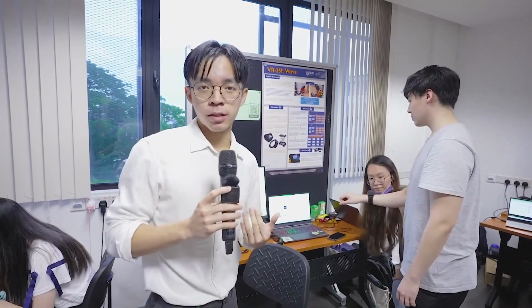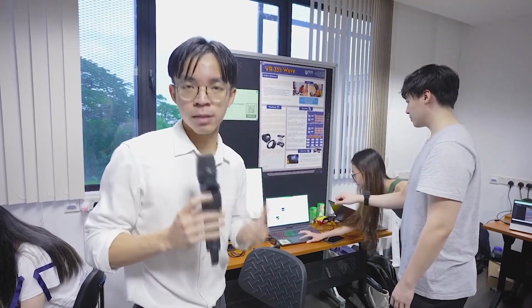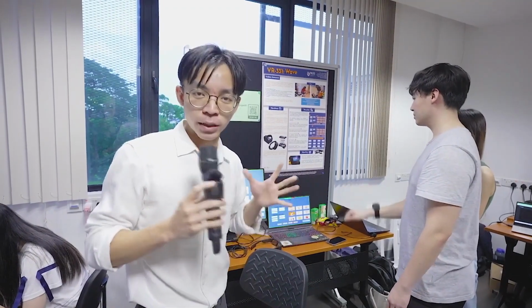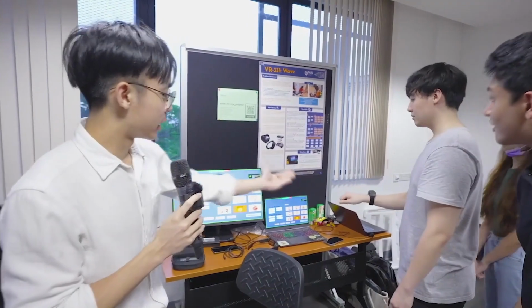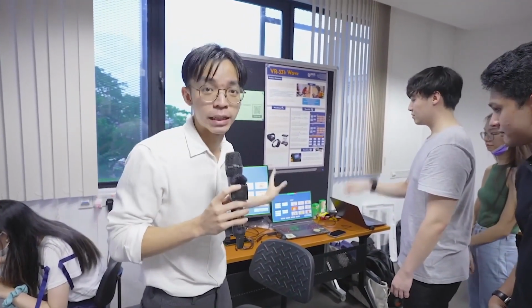And so the solution to this is we want to develop this interface, which we have, to put it on their wrist, and so it can track their own range of motion, to customize it to their needs. So for example, if they move in a certain awkward position, we can take that and we can map it to a certain computer input, right? So we're building the interface around them. So I think we have the demo here. So for example, it can detect motions like up, down, left, right, and to interact with this thing called AAC.